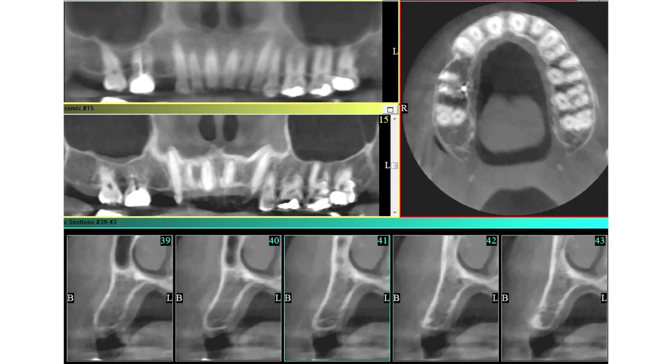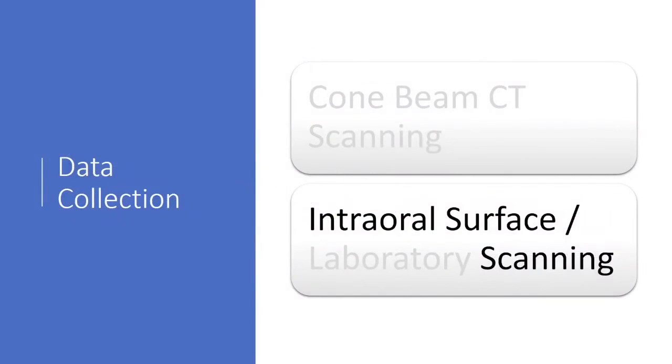If we take a look at the cross-sectional images, those are the images at the bottom, we'll see the volume of bone that Tidra has. Tidra has a lot of bone. I picked somebody that not only would get up here on the stage, but I also didn't want to make an overly complex procedure. So that's number one.